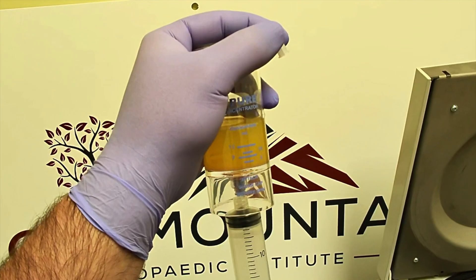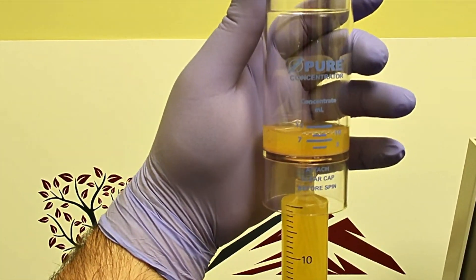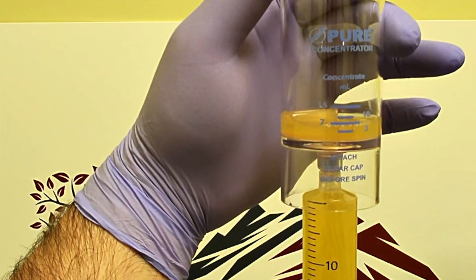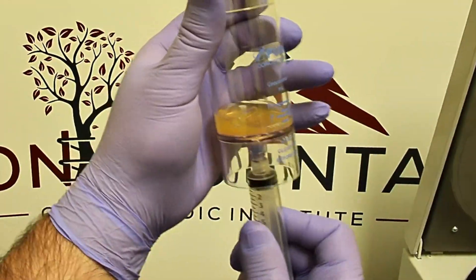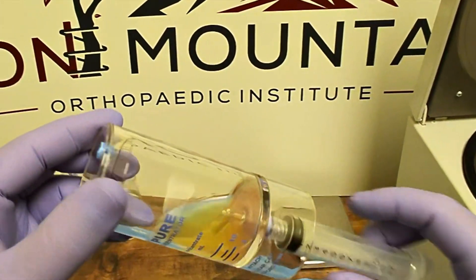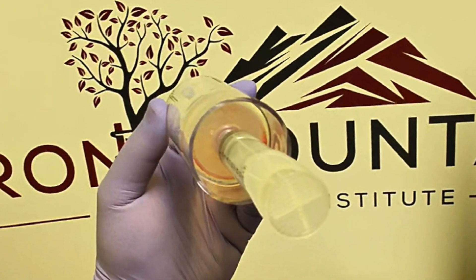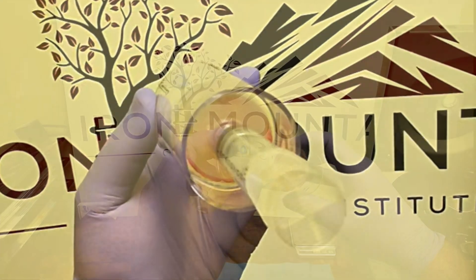The platelet poor plasma is then removed from the concentrator device, leaving the volume necessary for the procedure planned, which in this case is 7 cc. Once the desired volume remains, the injection syringe is attached to the concentrator device and the plasma is manually mixed to resuspend the buffy coat and all platelets coating the bottom of the concentrator device.